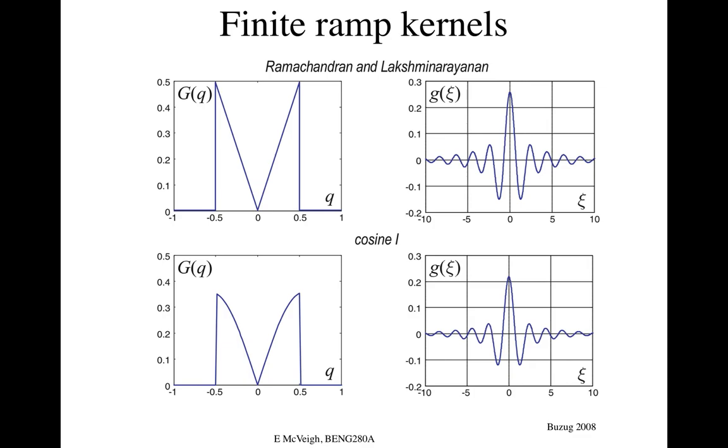The creation of these convolution kernels became a cottage industry, I guess, in clinical CT, and that was: how do we estimate this function? So this is in one-dimensional Fourier space, where this should be rho. For some reason it's q, or in R we call it k, sort of radial k through the Fourier space. You actually have zero at the origin. That means the mean value of the whole thing is zero, which is kind of a strange thing. This is often not set to zero.